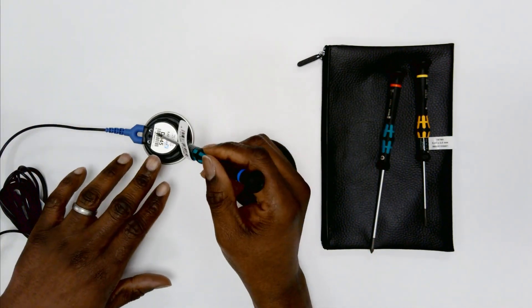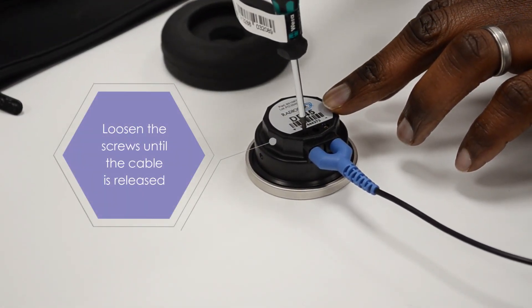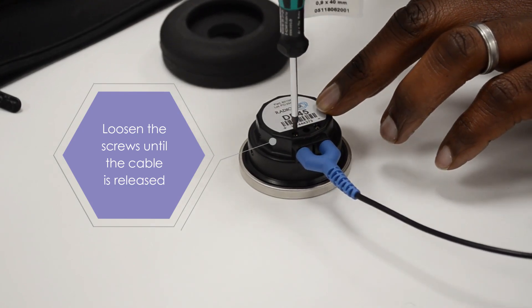Unscrew the fixing screws on the retaining lead in the earphone. These do not need to be fully removed, just loosened enough to allow the cable to be released.